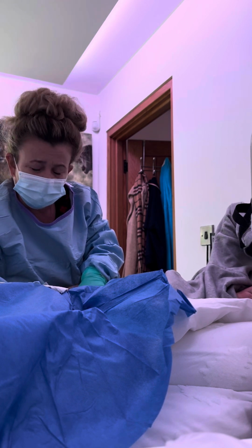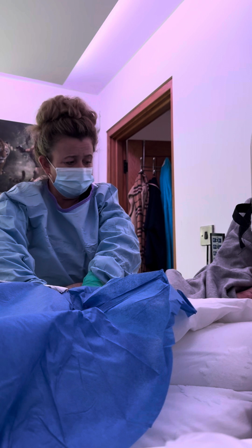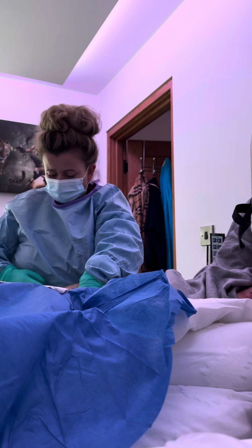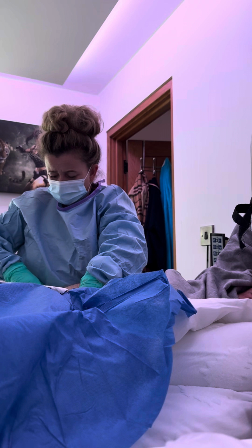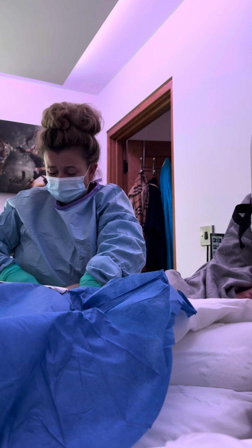So I'm giving it a little tug and a little pull, and I'm just going to pop it, see if it'll go in. Breathe, breathe, breathe. You all right? Yes or no? Yes. And then what I'm going to do is try and get the balloon in and use my body to do it. That was definitely out, I think. It is out. It was out by a few centimetres.